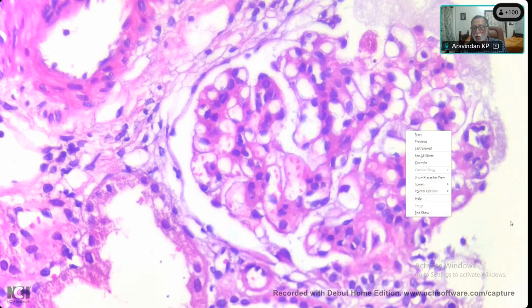When I use the pointer, I can't seem to be able to get back easily. See, can you see this? 1, 2, 3, 4, 5, 6, 7, 8, 9, all bunched together in the mesangium. Yes, sir. This is mesangial proliferation, hypercellularity. This is a very typical picture that you see.